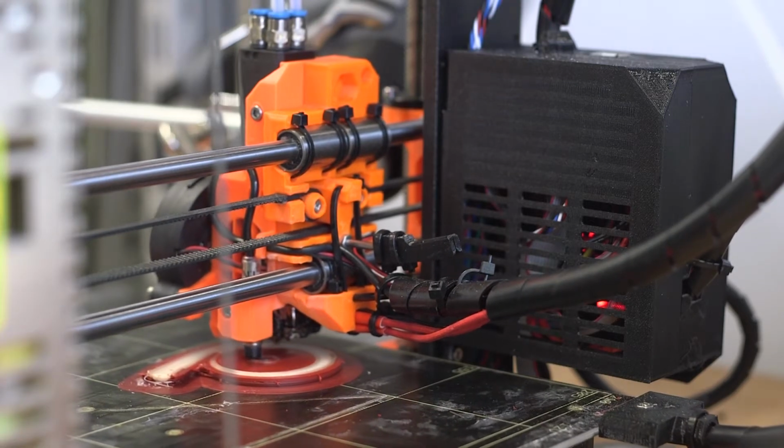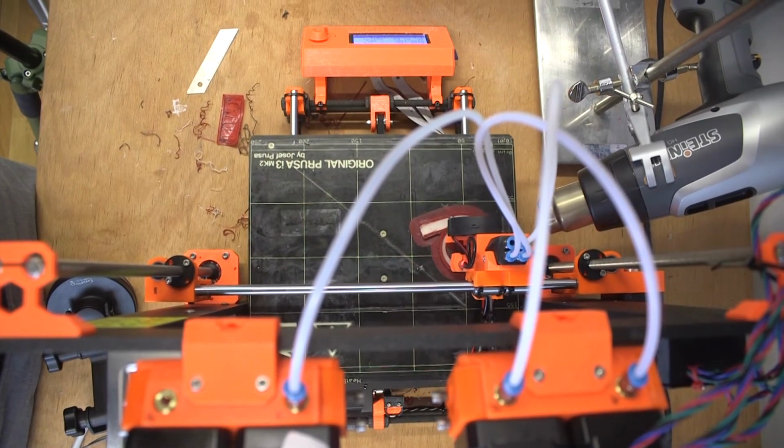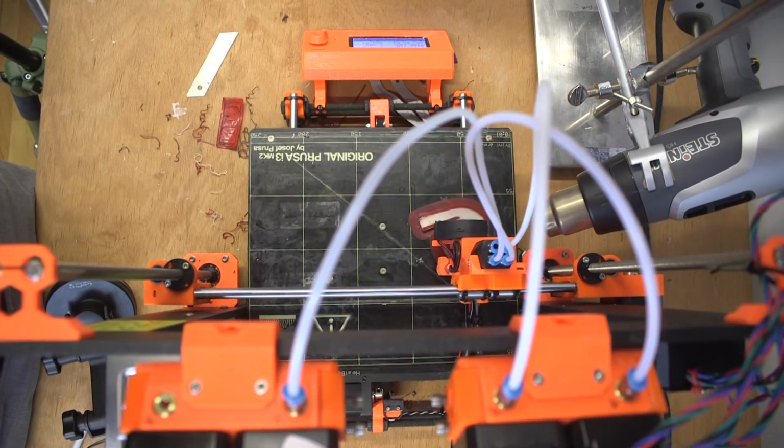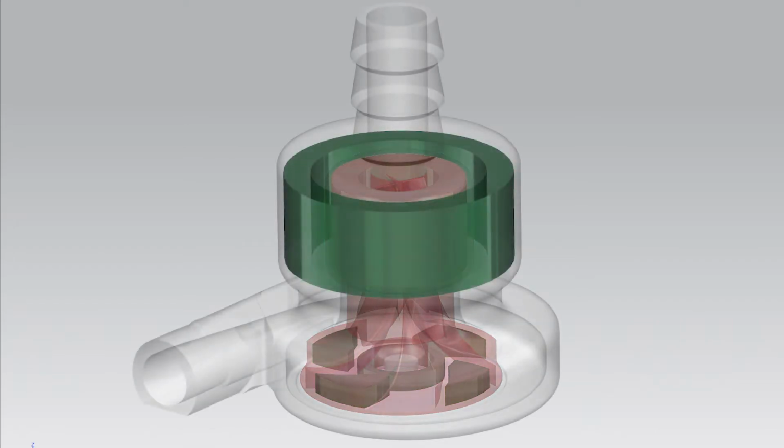This is our very first proof of concept prototype. In terms of materials, printing precision and reliability, there still is a lot of work to be done. However, I think embedded magnet printing has the potential to change the way engineers test and iterate new designs. This method allows you to develop more complex and innovative structures that would otherwise not be manufacturable, and you can test and iterate those designs in a matter of hours rather than weeks.